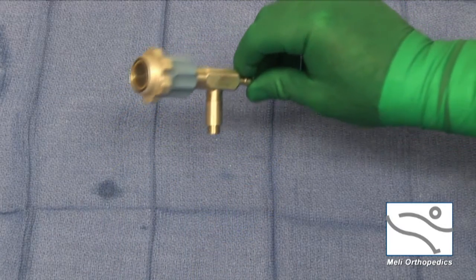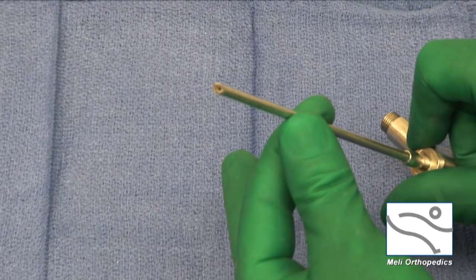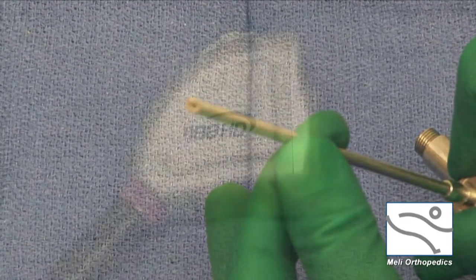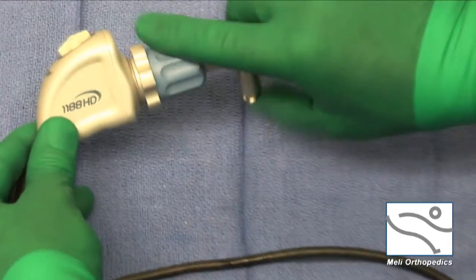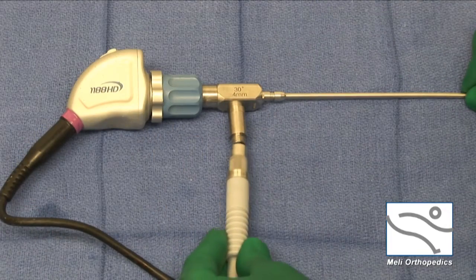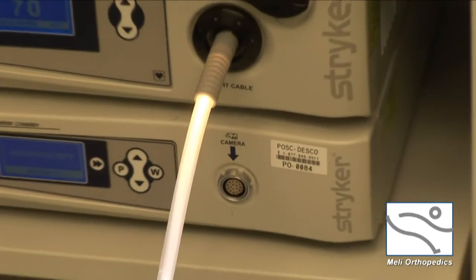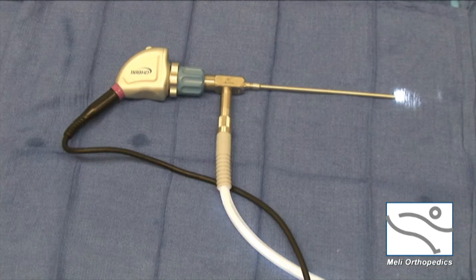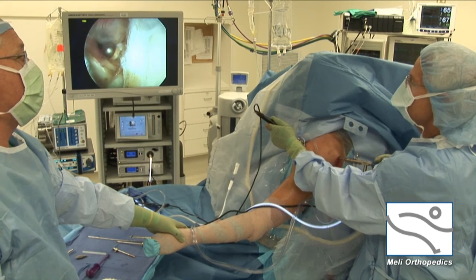The arthroscope is what makes arthroscopy possible. The arthroscopic lens is less than three millimeters in diameter, yet it has high definition lenses which provide extraordinary visual detail. A high definition video camera attaches to the arthroscope which displays the video on large monitors. A high intensity light source also attaches to the arthroscope and transmits light through fiber optic cables. The fiber optic cable carries light from the light source through the arthroscope and to its tip where the camera lens is located, lighting the inside of the shoulder joint for a perfect view.